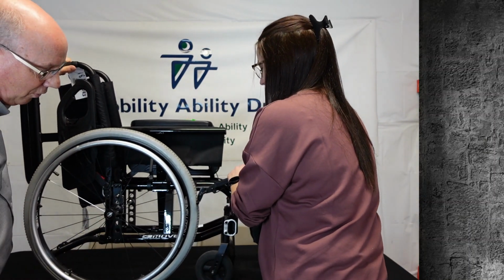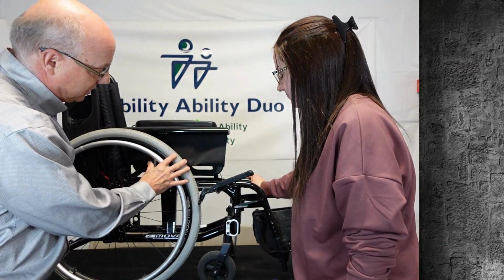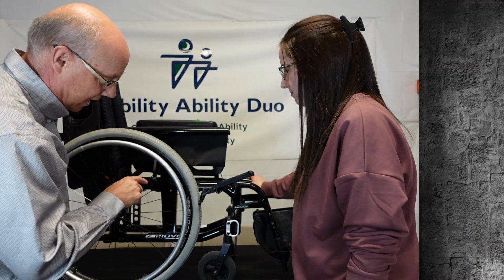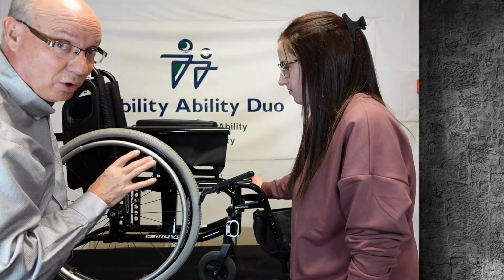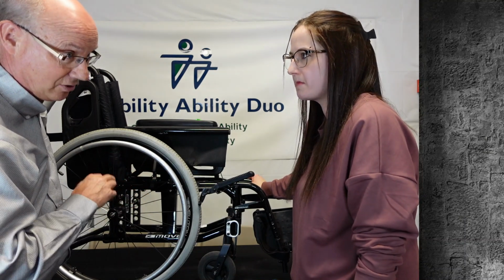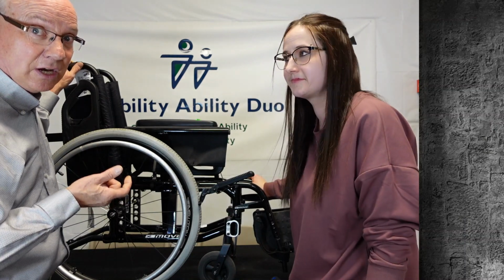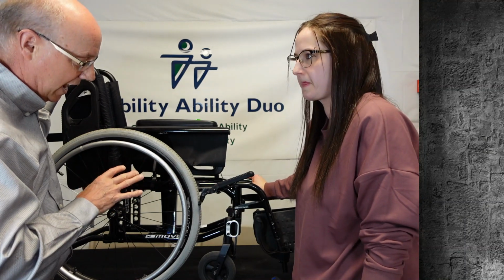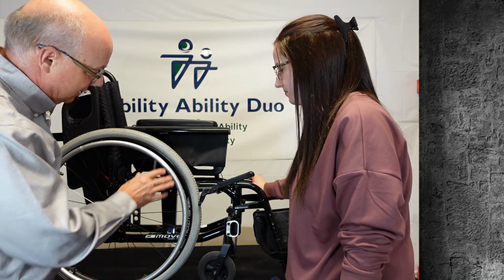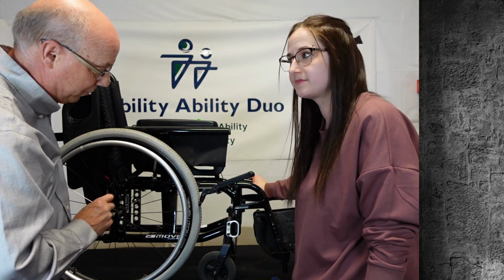Ooh, that's biting into the tire. Now this is a pneumatic tire, and this is really important. This particular tire is an air tire. There's air inside of it with the tube. You've got to inflate it to the right amount of pressure before you adjust any brakes. Sometimes it's just that the tire's low. Lots of wheelchairs have urethane tires, which are solid tires, and you don't have to add air to those. This particular one is an air tire, so we made sure that it had the proper inflation. It says on the tire what you need for proper inflation.